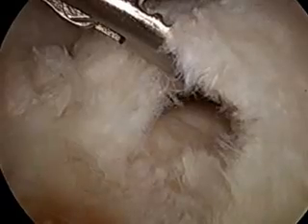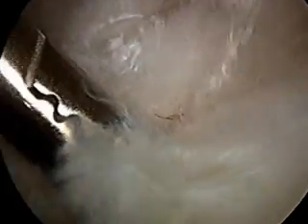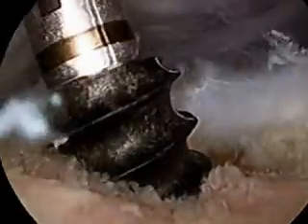This video shows a fairly typical rotator cuff tear. Here you see a torn portion of the rotator cuff tendon. Here we are with a grasper pulling the rotator cuff tendon back down to a portion of the humerus bone where it belongs. And the goal of this operation is to secure that rotator cuff tendon back down to the bone where it belongs.